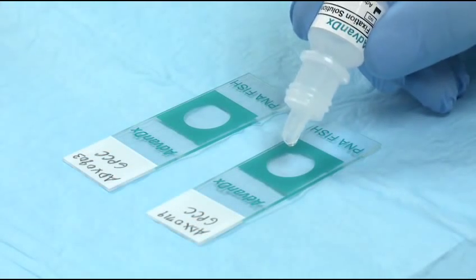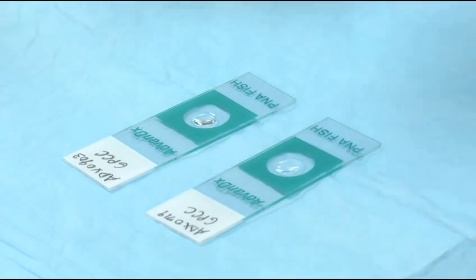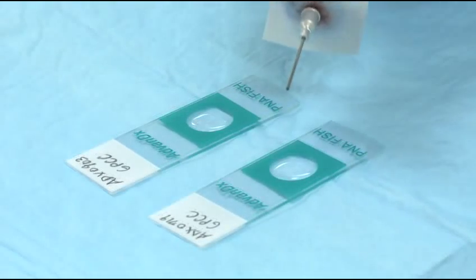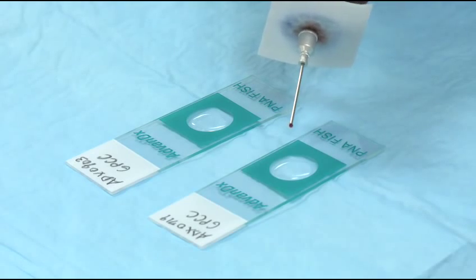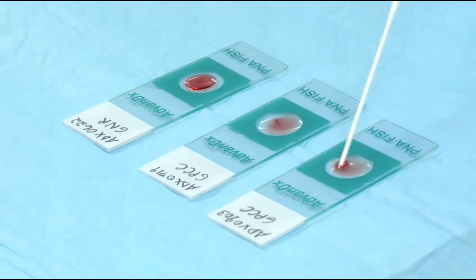Add one drop of fixation solution to the well of each microscope slide. Then transfer 10 microliters, or one small drop, of the blood culture to the drop of the fixation solution. Mix gently with a sterile tip to emulsify.